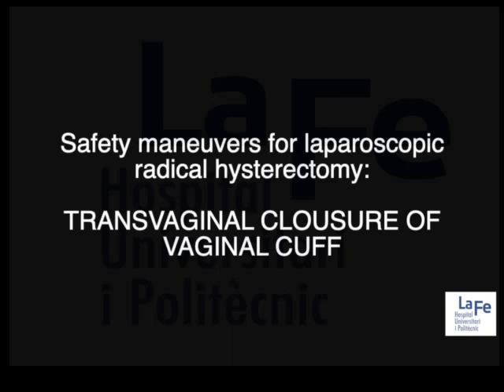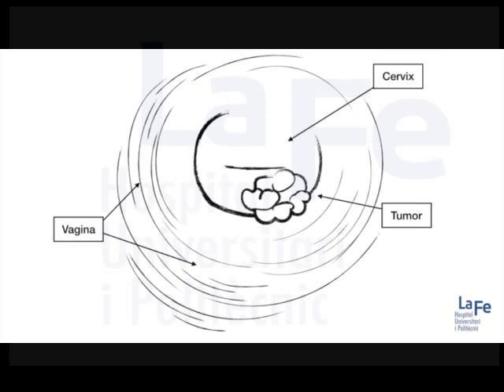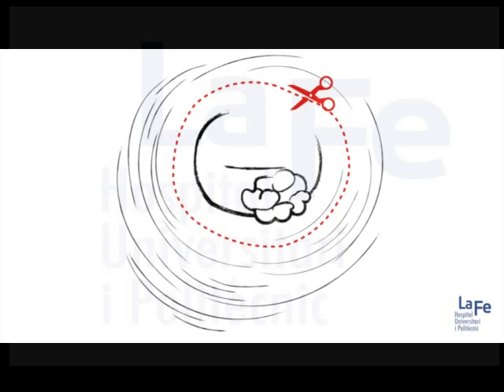In this video, we explain step-by-step the vaginal cuff closure technique in a patient with a macroscopic cervical tumor, 2 centimeters in size, limited to the cervix. A circumferential incision at the vaginal mucosa is performed to create a vaginal cuff for covering the tumor, as can be seen in the schema.